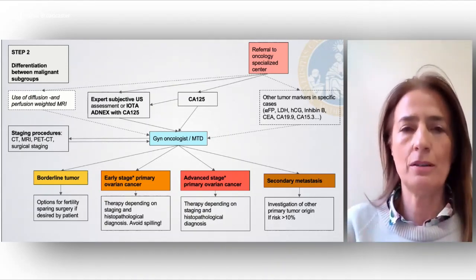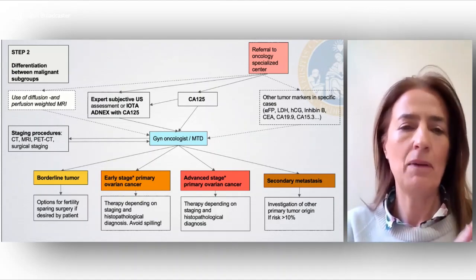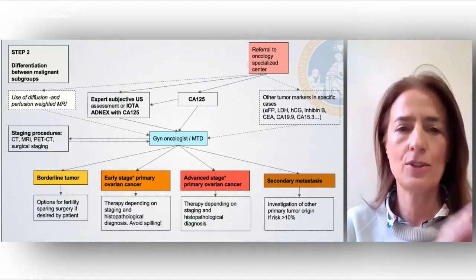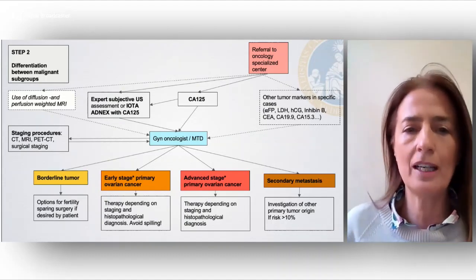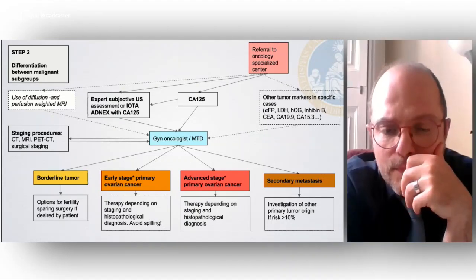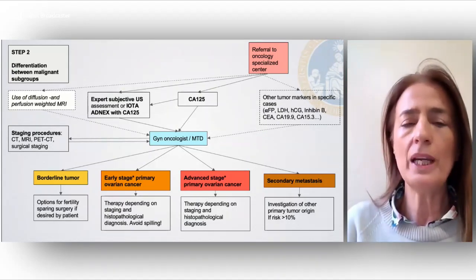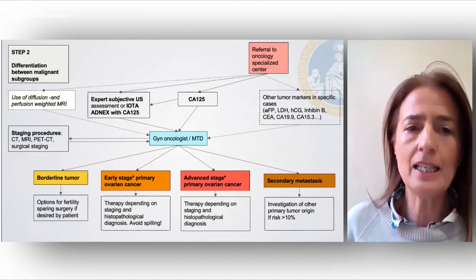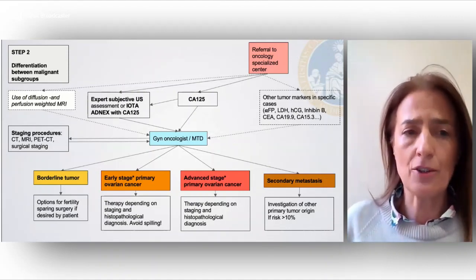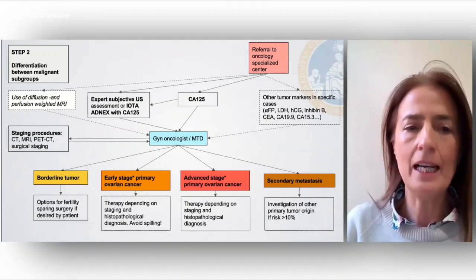So this situation can be either epithelial, bilateral, high-grade serous carcinomas, or could be metastasis. Do you agree, Matt, with this interpretation? So, for sure, as Francesca said, we assessed the extension of the disease by using ultrasound, and we have been working on that to look for some criteria of inoperability.